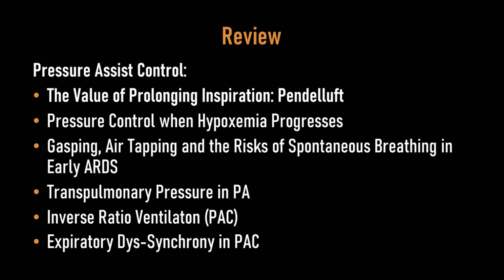Then I went on to discussing the use of pressure control as hypoxemia progresses and the strategies that people tend to use. I discussed in the middle of that gasping and the problem of patients taking huge breaths in early ARDS and the problem with gas trapping and stretch injury to the lungs that's sometimes known as self-induced lung injury.